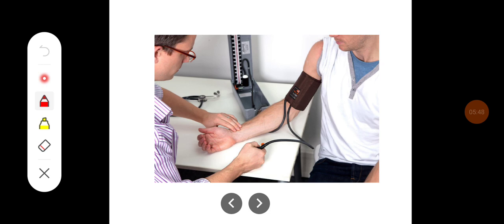So this is how you record the systolic blood pressure by palpatory method. After tying the cuff, you increase the pressure by pumping the air, and you pump the air till the pulse disappears.